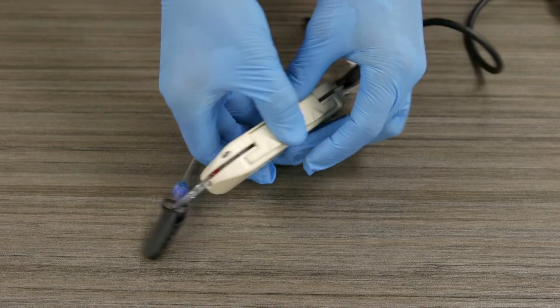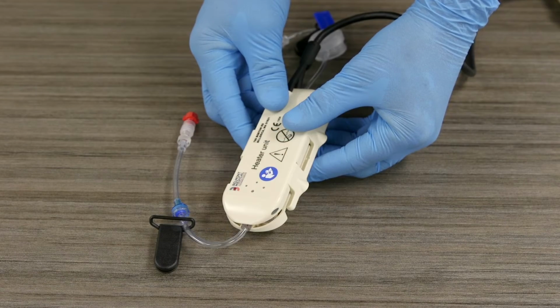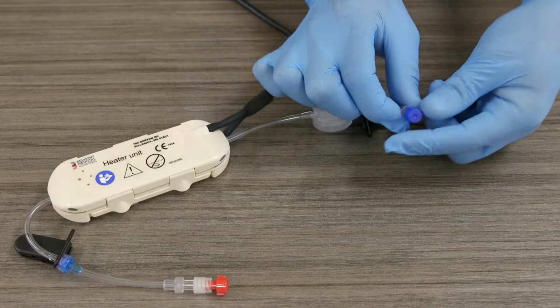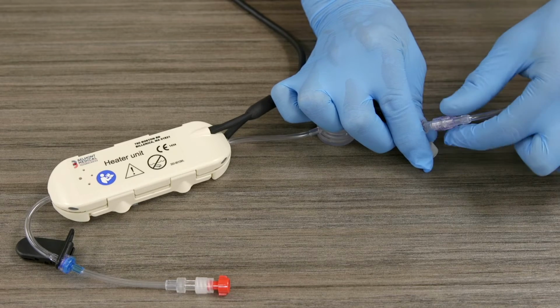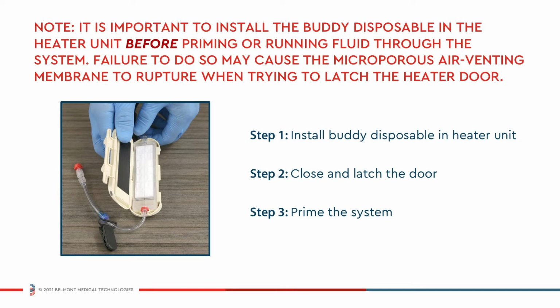Close and latch the heater door. Do not force the door closed. If the disposable is incorrectly positioned, the heater unit will not close properly. As a last step before moving to priming, disconnect the blue luer cap from the Buddy disposable and then connect any administration set to that luer fitting. Note, it is important to install the Buddy disposable in the heater unit before priming or running fluid through the system. Failure to do so may cause the microporous air venting membrane to rupture when trying to latch the heater door.